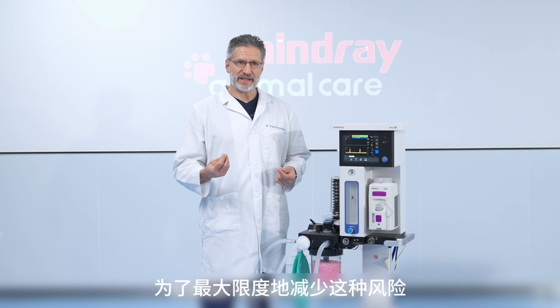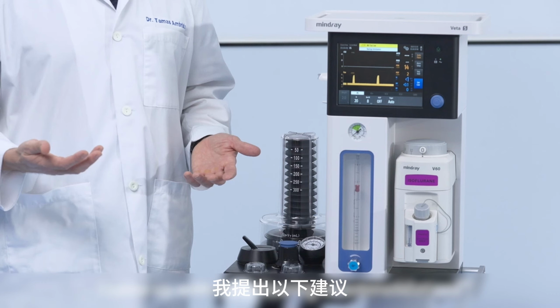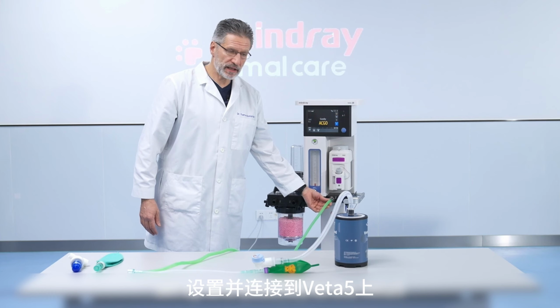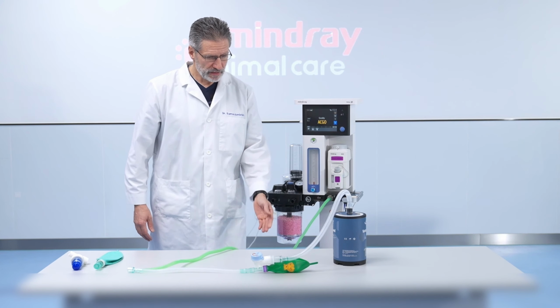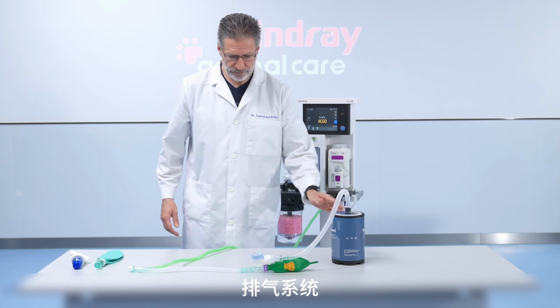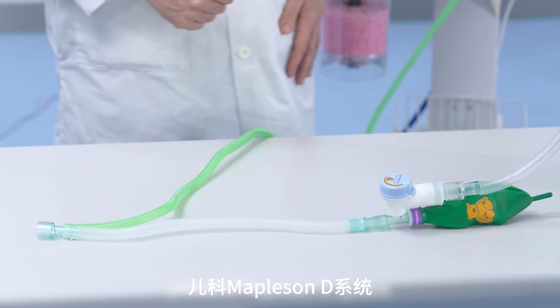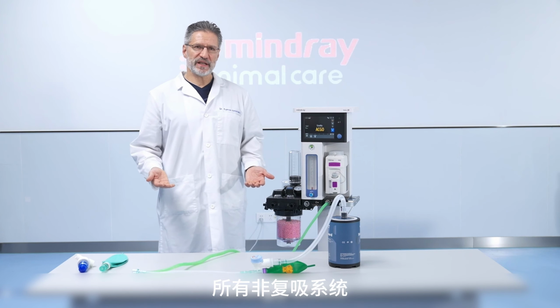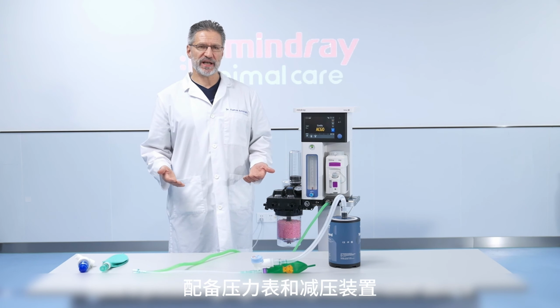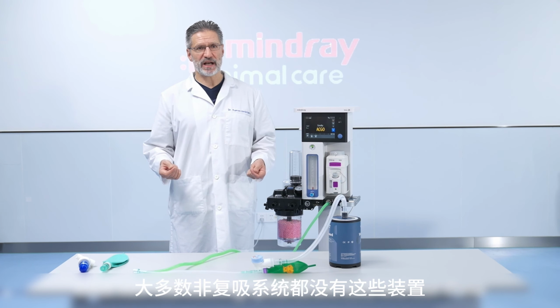In order to minimize this risk and improve the safety of non-rebreathing systems, I came up with the following recommendations. Here is a non-rebreathing system set up and attached to the Veta 5. There is a VetaGuard scavenging system attached to it. And this is the Intersurgical Mapleson D pediatric system. I strongly believe that all non-rebreathing systems should have a pressure gauge and a pressure relief device. Unfortunately, most non-rebreathing systems are sold without these.